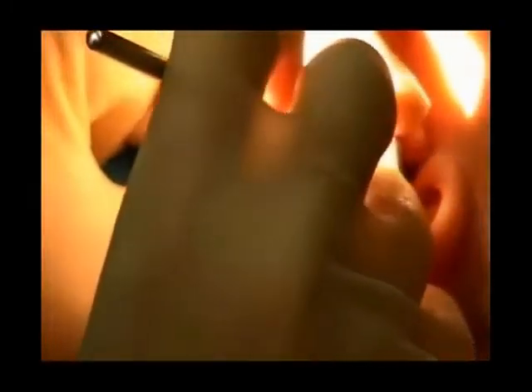The more times that you put an instrument in and out of the ear canal, the greater the risk for damage to surrounding structures. The surrounding structures would be the wall of the ear canal or even the tympanic membrane. The skin of the ear canal is some of the thinnest skin in all of the body. So one tiny little touch on this skin and it starts to bleed. If you have bleeding in the ear canal, and this procedure is done under a microscope, you can't see anything. So then you have to remove the blood and you have to get a clear surgical field before you can safely put the tube in.